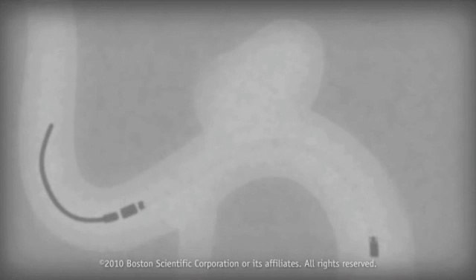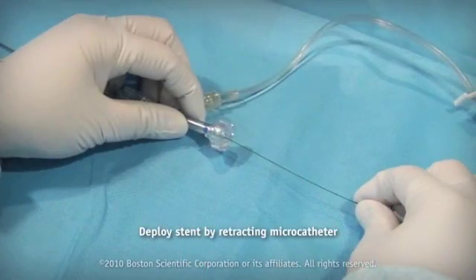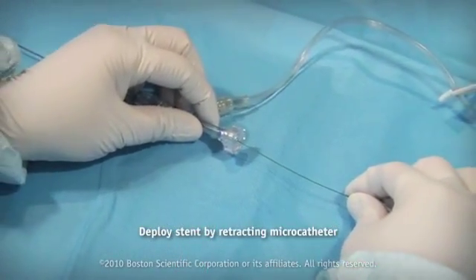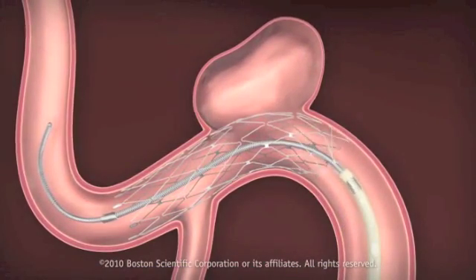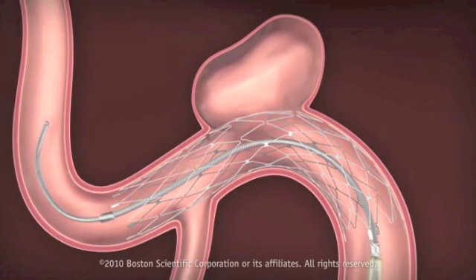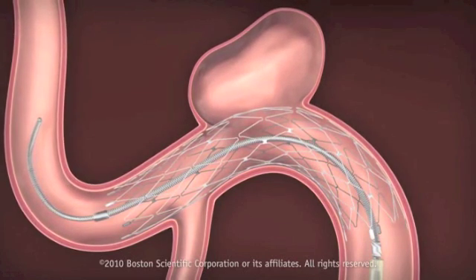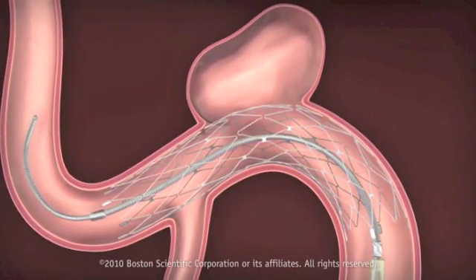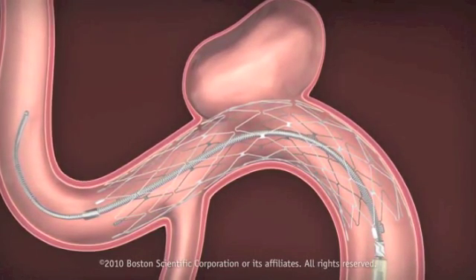Maintain approximately 4 mm of stent length on each side of the aneurysm to ensure appropriate neck coverage. When the stent positioning is satisfactory, deploy the stent by carefully retracting the microcatheter while maintaining the position of the stent delivery wire. It may sometimes help to maintain some forward pressure on the stent delivery wire to ensure it stays put. Do not use the stent delivery wire to push the stent out of the microcatheter while deploying.